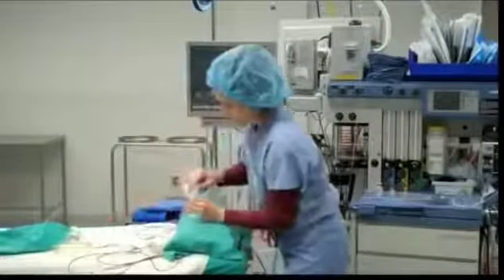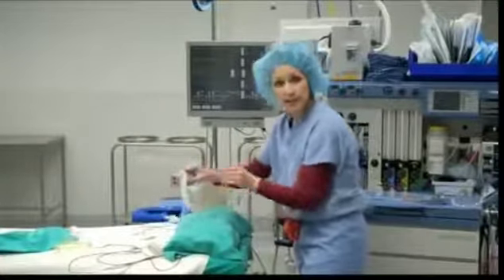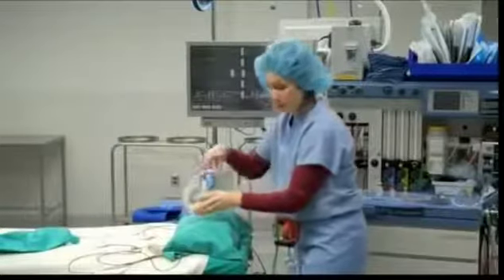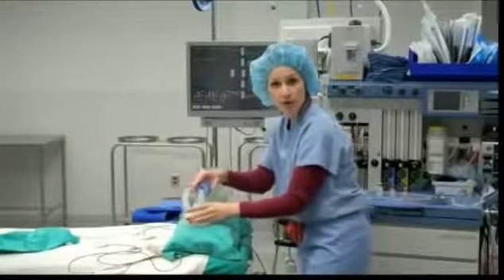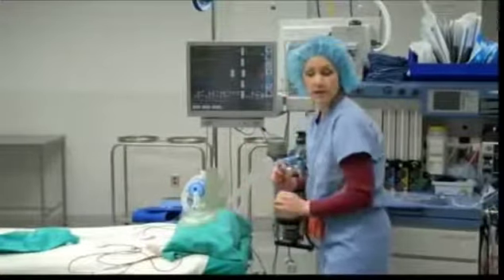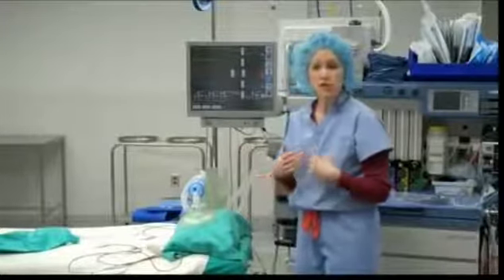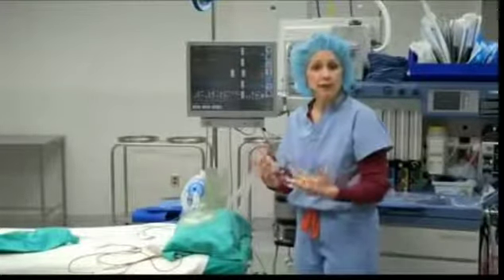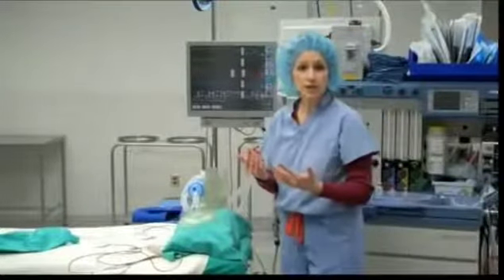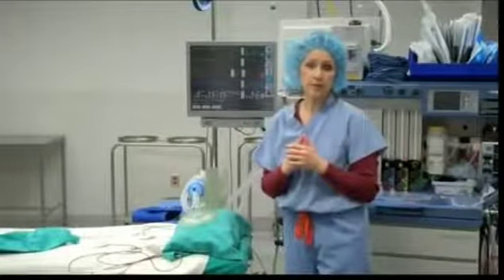Okay, so here's our breathing tube that was attached to the circuit. We then go ahead and gently take the breathing tube out. Okay, we put the mask back on the patient's nose and mouth. Okay, and then have them just breathe in the oxygen through the mask. Okay? So at this point, we're continuing to assess our patients, making sure that they're comfortable. If they're not, we can go ahead and give them additional pain medications. Okay? And then we then go ahead and transport them to the recovery room.